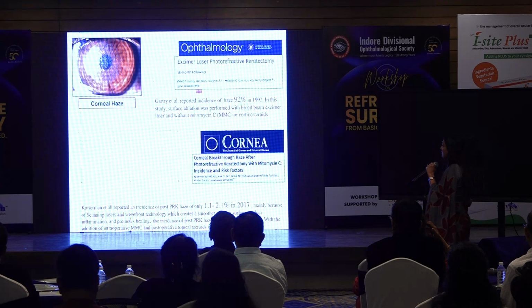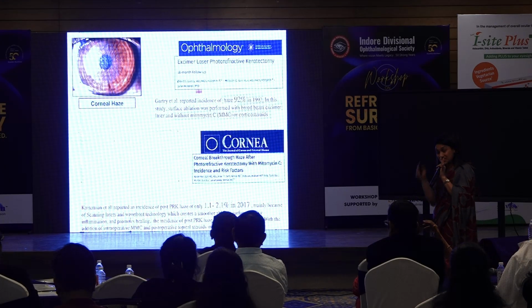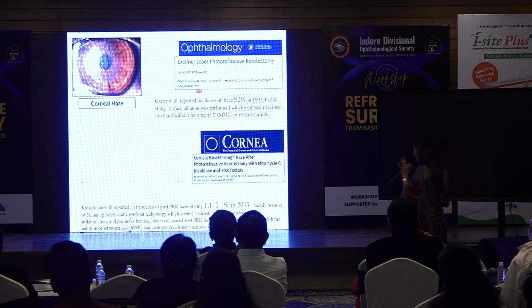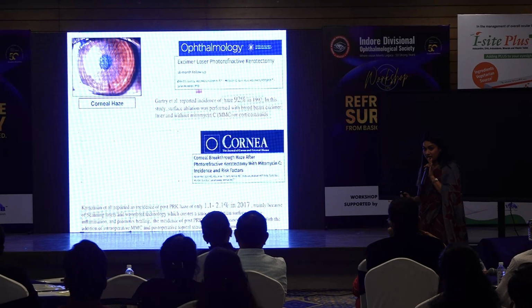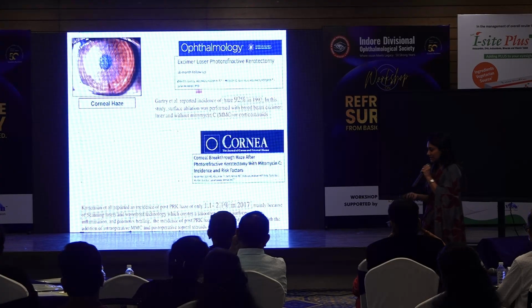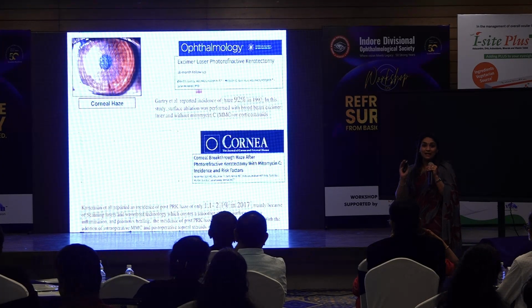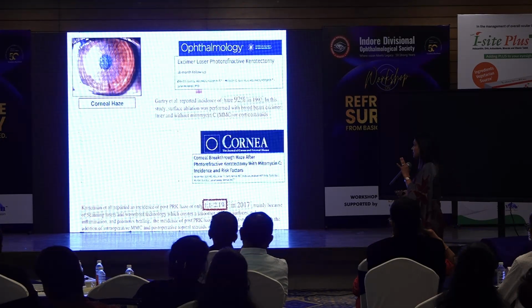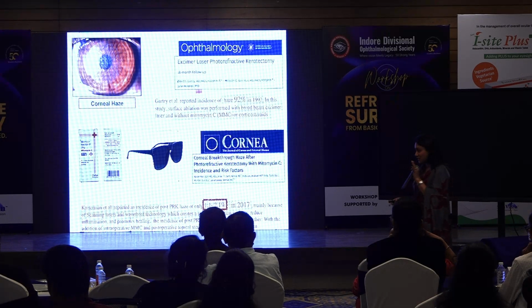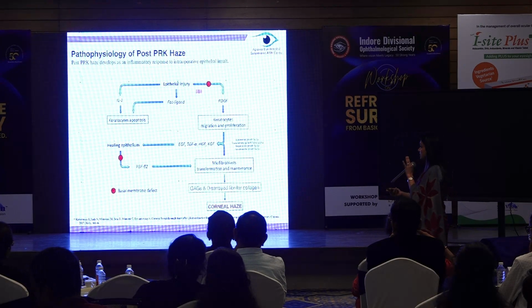The most important is post-PRK haze, which most of us dread. Earlier, with traditional broad beam lasers, where we did not use mitomycin or steroids, I'm talking about way back in 1990, the incidence of haze was definitely higher. But with the new techniques, with the use of mitomycin, steroid, and better excimer laser systems, PRK haze is significantly reduced, to close to less than 3%. But usually we don't even want those 3%, because these are refractive patients. How we can do better to reduce PRK haze is something we discussed in the morning.